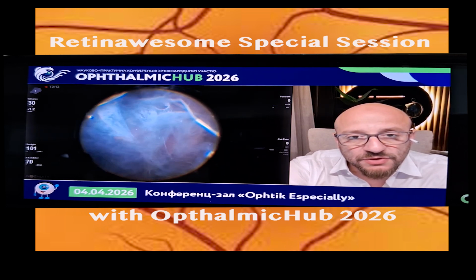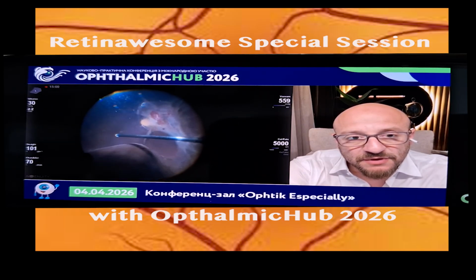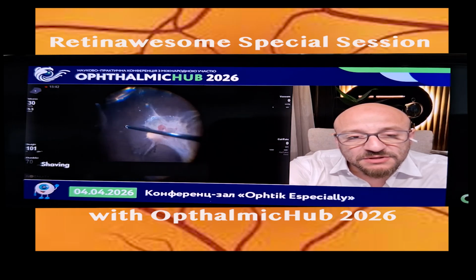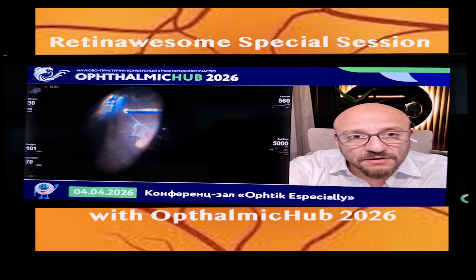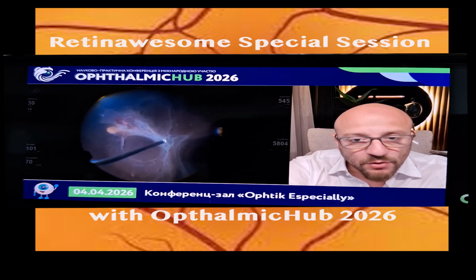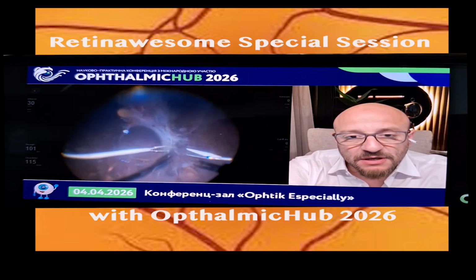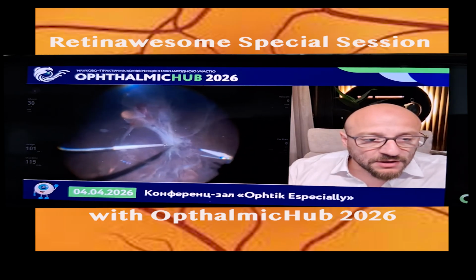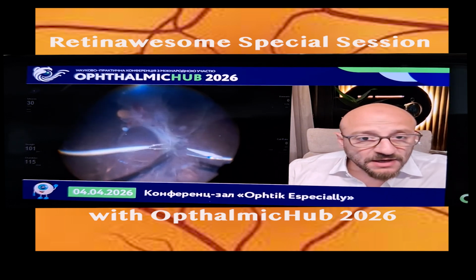I also use triamcinolone to make sure that there is no vitreous in this mid-peripheral zone, and then I proceed to do the shaving. I do the shaving early on to get over with an essential step, actually, so as to be able to do the rest with a relaxed mind.